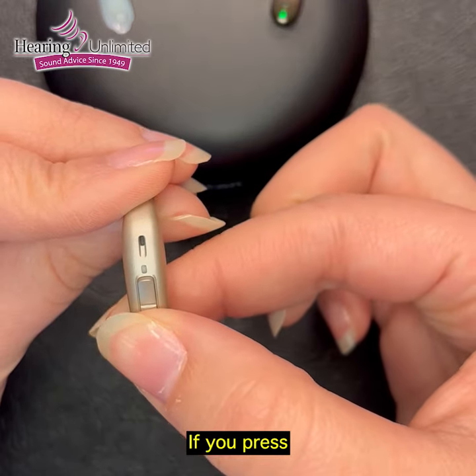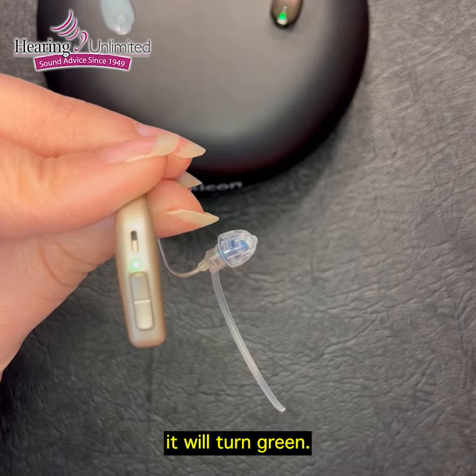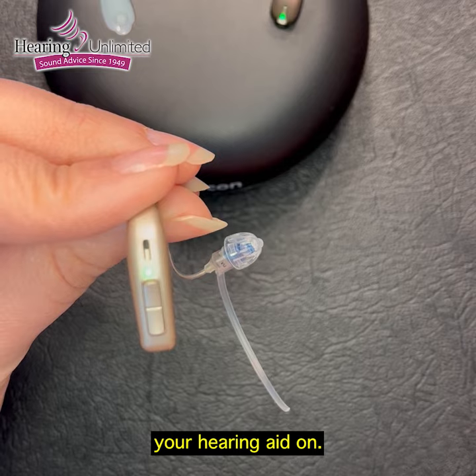If you press and hold the bottom button again of the rocker, it will turn green — that means it is now powering your hearing aid on.